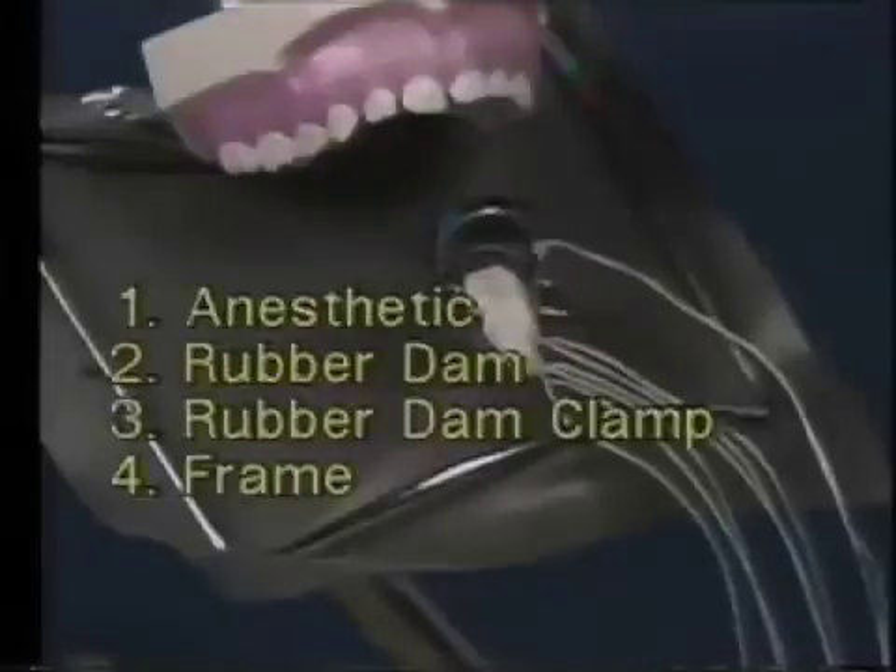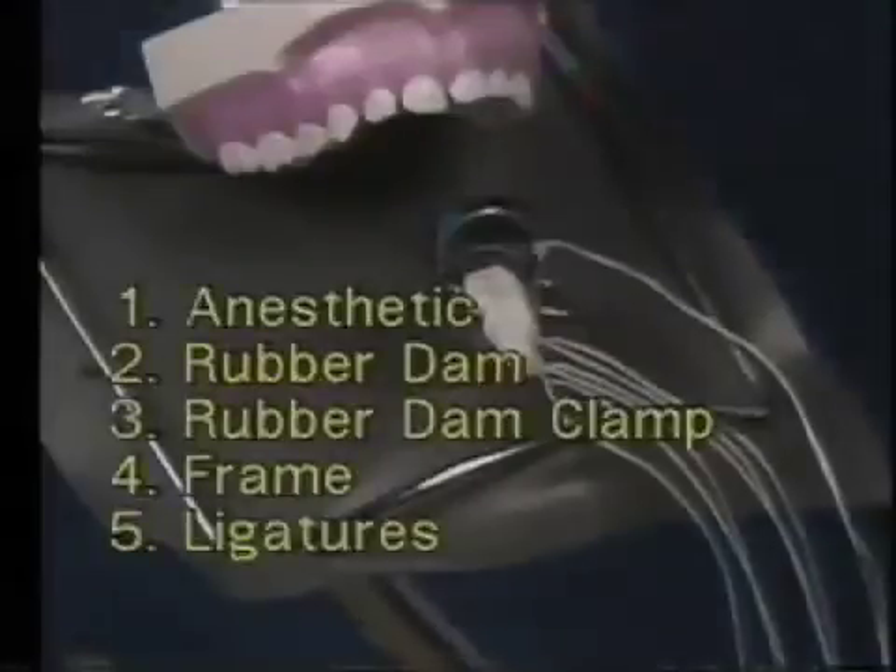The first part is the anesthetics of the frame and the ligatures. For most patients, the anesthetic you inject to anesthetize the teeth will also anesthetize the soft tissue around the tooth on which you will place the clamp. However, if you feel that the clamp will impinge excessively on the palatal gingiva by a maxillary molar, you should consider injecting a small amount of anesthetic in the attached gingiva on the palatal. This is a painful injection, so you should consider the indication carefully before injecting here.